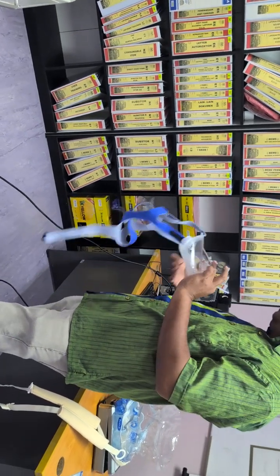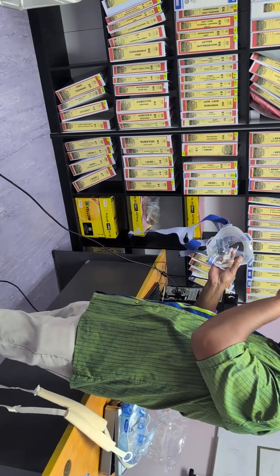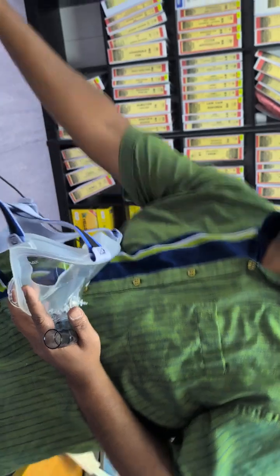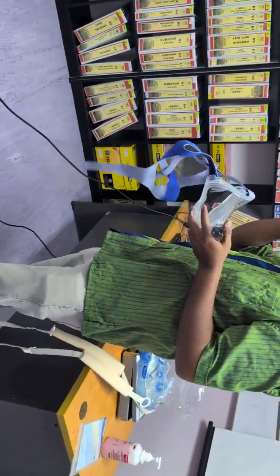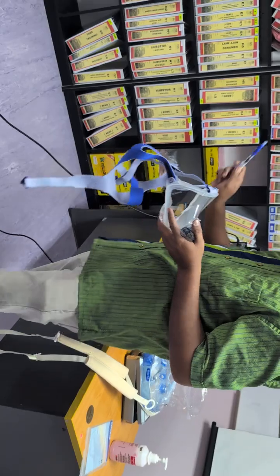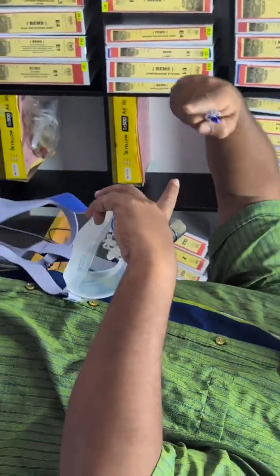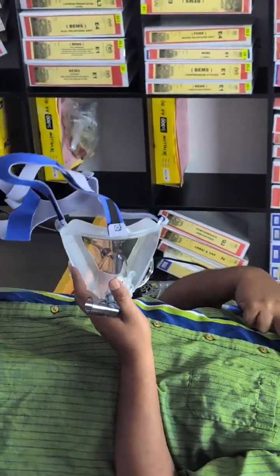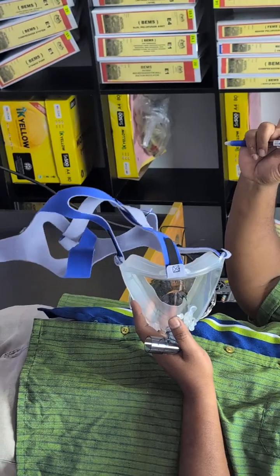Okay, they are considering that, but I'm telling you, this is cheap. It is okay. This is re-sterilable, autoclavable 10 times. They have given you the list. Every time we have to stamp it. Okay, I am going to tell you, don't autoclave.